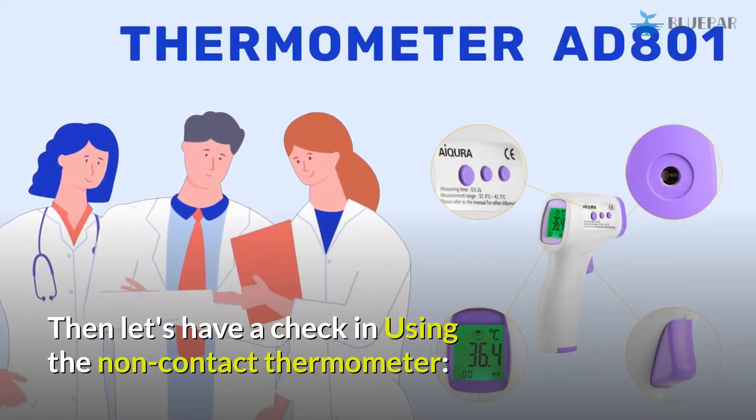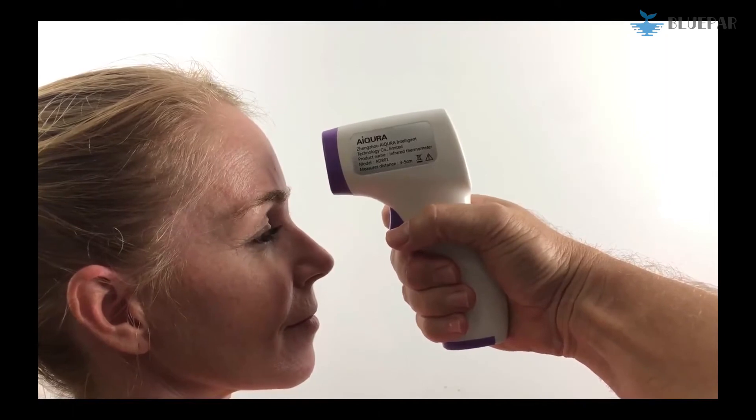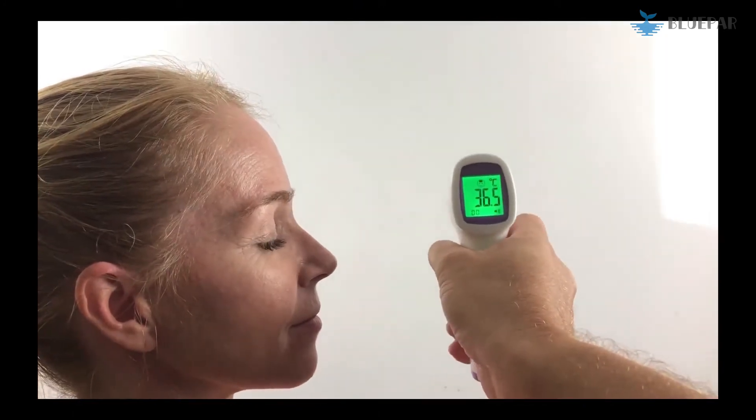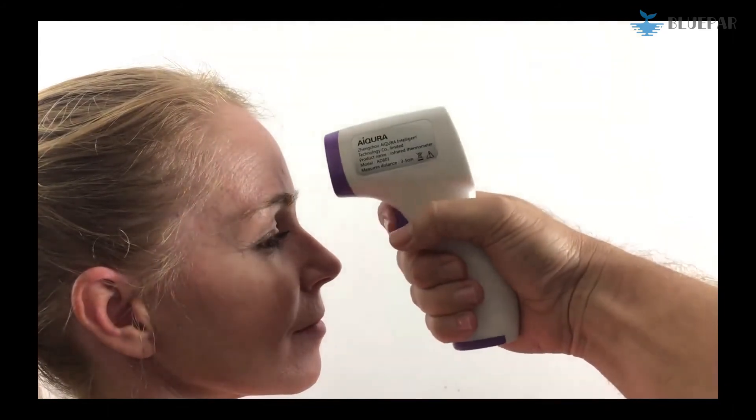Now let's demonstrate using the non-contact thermometer. To take a temperature sample, lightly press the trigger, holding the gun in a stable position 3 to 5 centimeters away from the candidate's forehead.